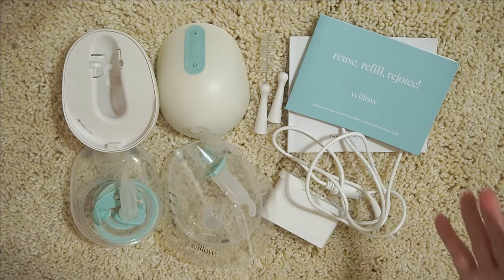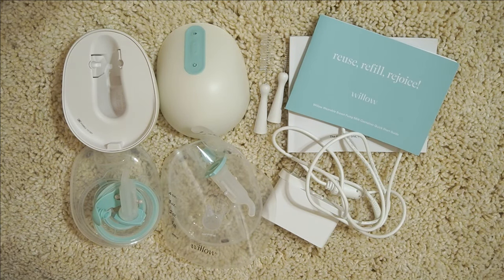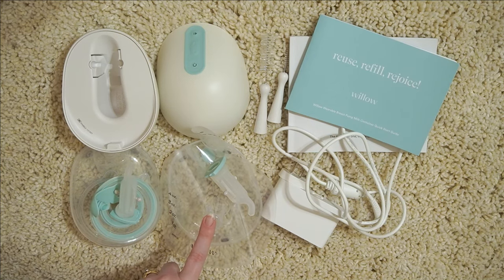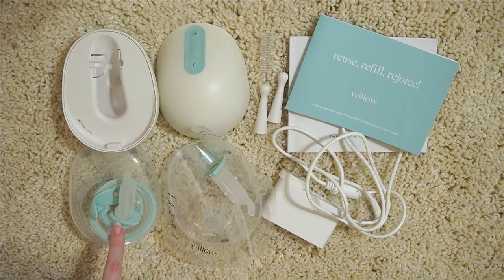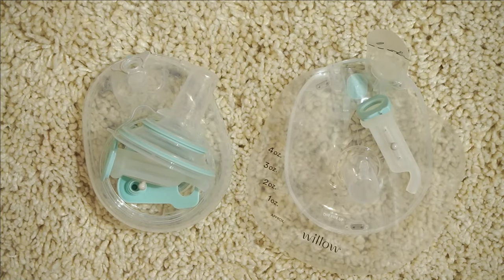This is basically everything that you would need to pump. The fact that you can have the reusable container or the bags — I'm going to walk you through both sides so you guys can see what that looks like. Now that I've walked you through everything it comes with, I'm going to walk you through how to assemble these parts so we can get ready for pumping. I've zoomed in so you're not going to miss anything. This might look intimidating but I promise it's not — it's actually really simple, and once you do it a few times you'll get the hang of it.